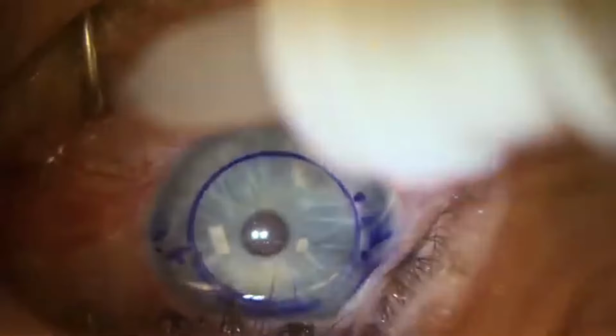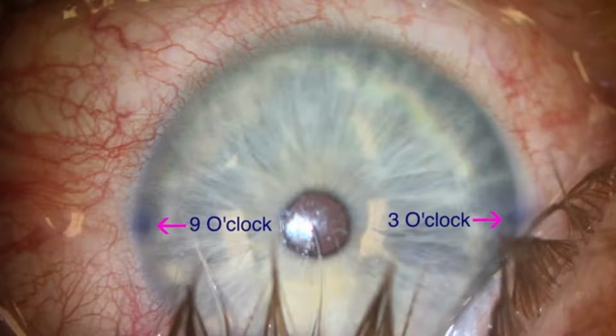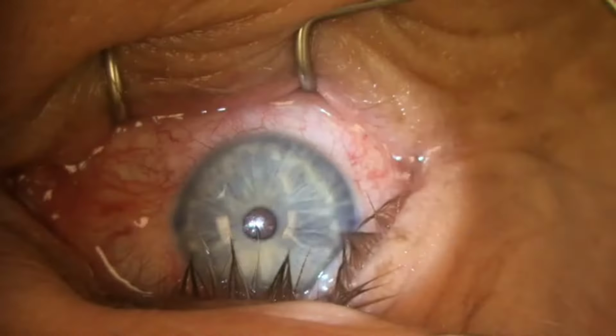We instill 3 drops of proparacaine anesthetic, then place a mark at the 3 and 9 o'clock positions of the limbus while the patient is sitting upright. Then the patient is reclined and positioned under the operating microscope. An eyelid holder is placed to keep the eyelids apart. The patient is then asked to look straight ahead at a fixation light.